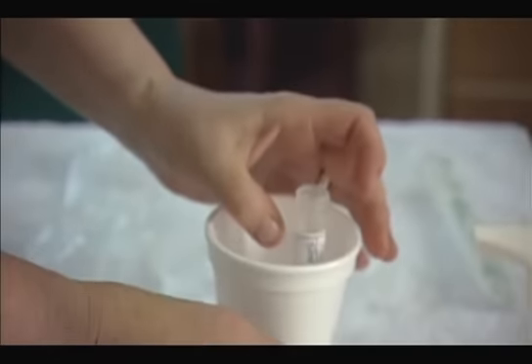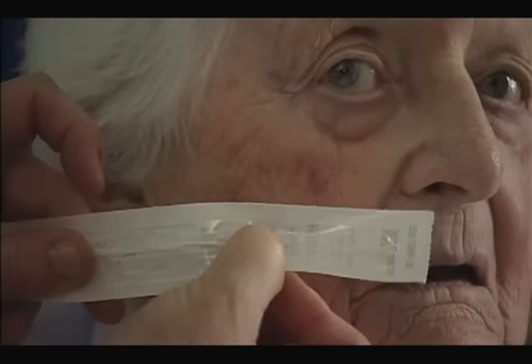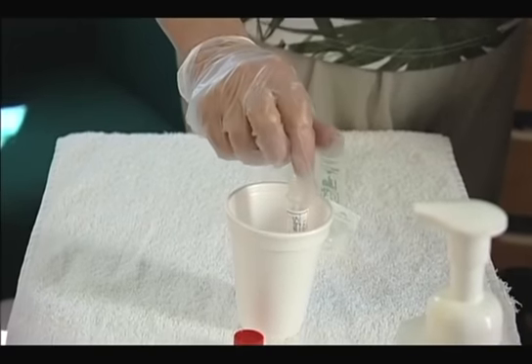The patient's nasal passages should be clear of mucus prior to insertion of the swab. Check the distance from the tip of the ear to the nostril and insert the swab to at least half that depth. Insert the swab into the nostril with a few rotations to help collect more cells from the nasopharynx. This process may cause the patient to sneeze or cough.